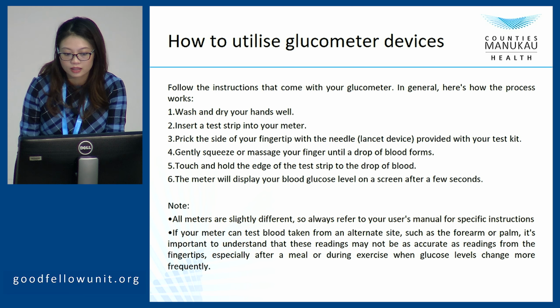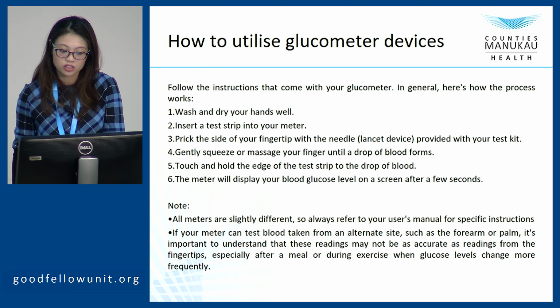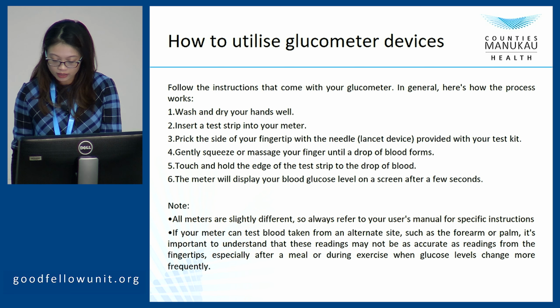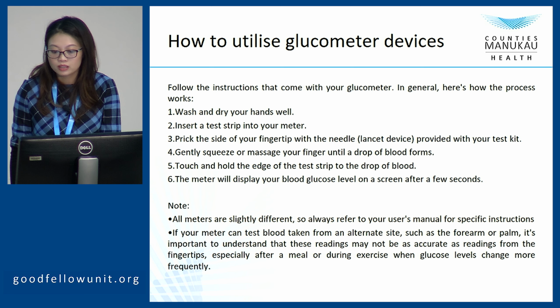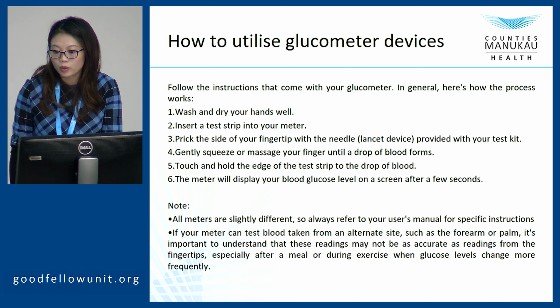All meters are slightly different, so it's better for the patient to follow the instructions. Some meters can test blood taken from different sites, such as the forearm or palms. So it's very important. This reading may not be as accurate as the reading from the fingertip, especially after a meal or exercise.